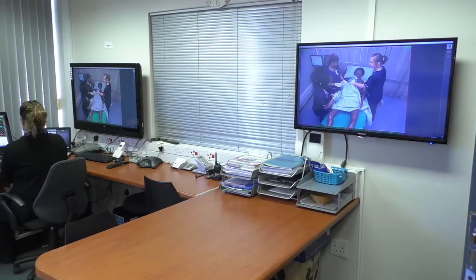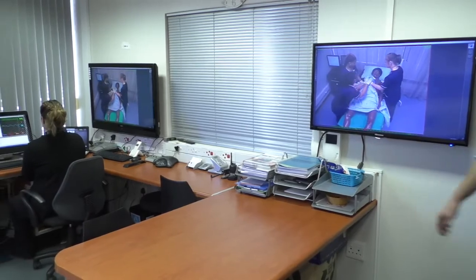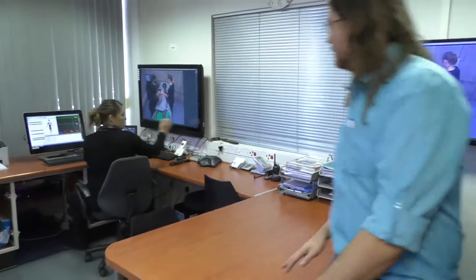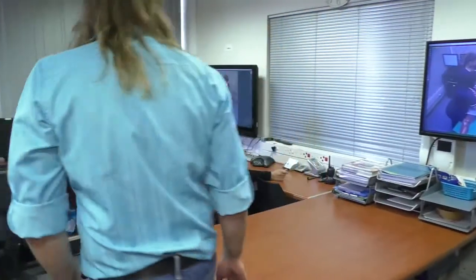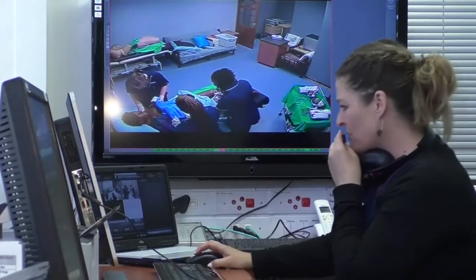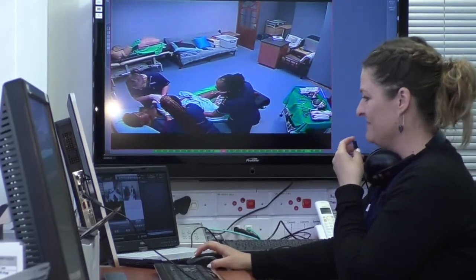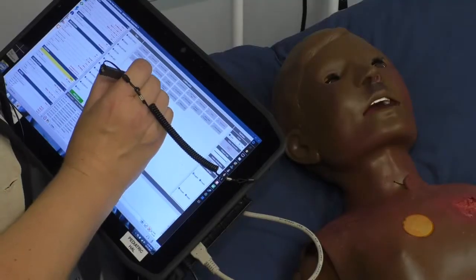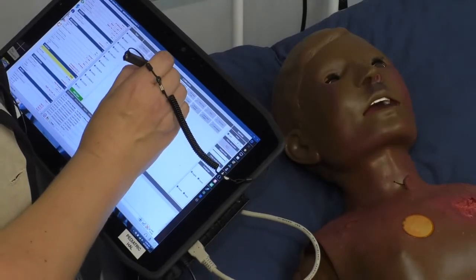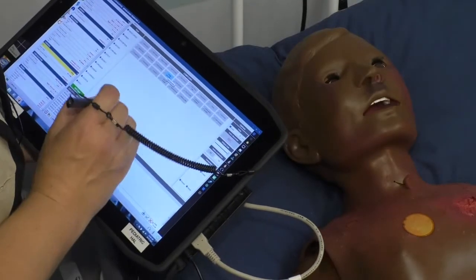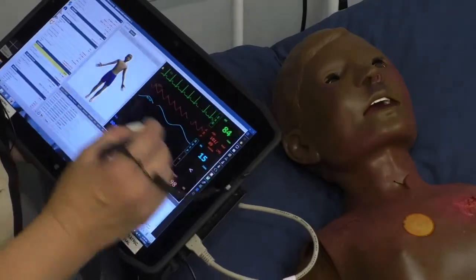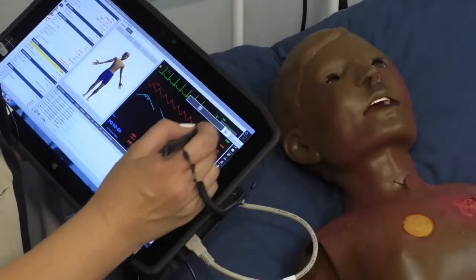Technicians control simulated scenarios from a control room where they are able to observe the actions of the students. Simulators can also be controlled at the bedside by using a tablet.